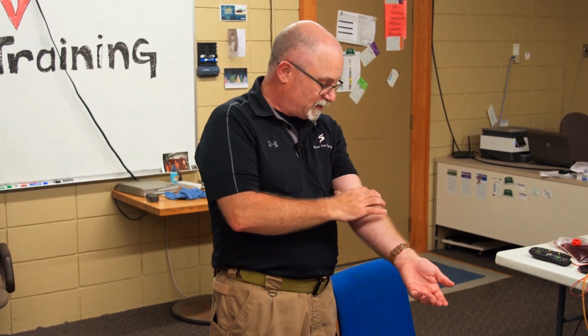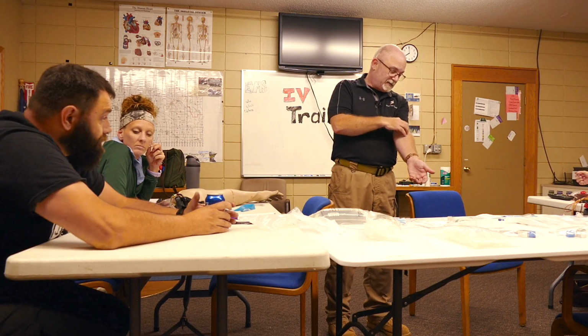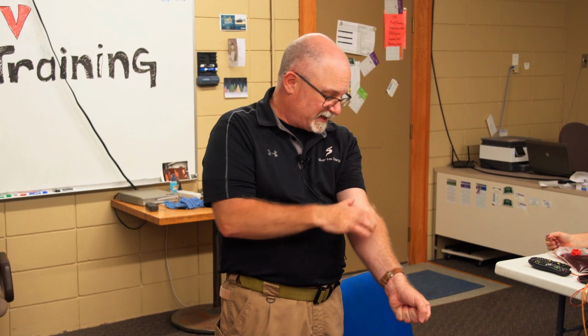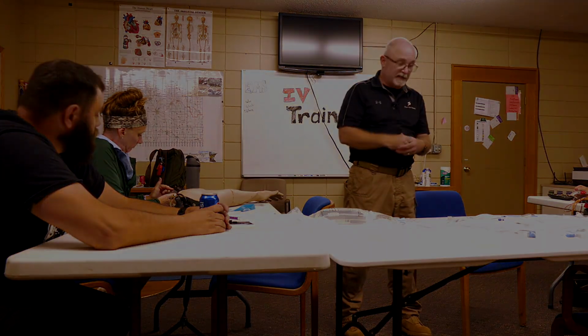Otherwise, with most people you've got one vein running across here and another one over here, and if you can sort of feel it, you say, well, I can't see it, but I can sort of feel it. So on mine, I will actually take my nail and make a little line about where I think it is, clean it one more time, and you can see just a little bit of that mark left behind, and I go in there and fish a little bit. I mostly do that on myself. So don't be doing that on most people, but it's another technique.